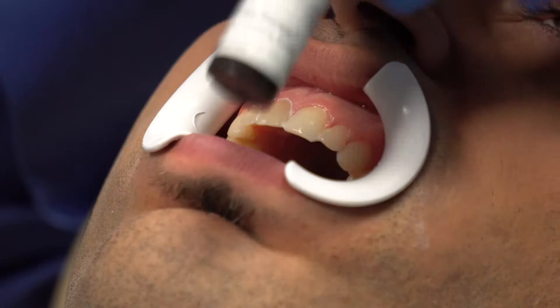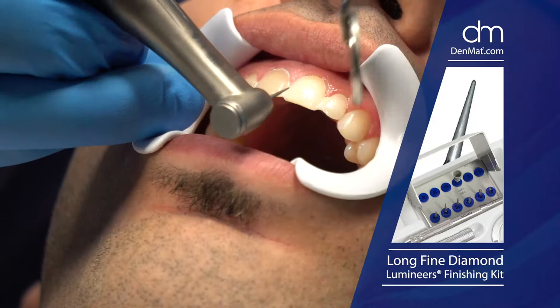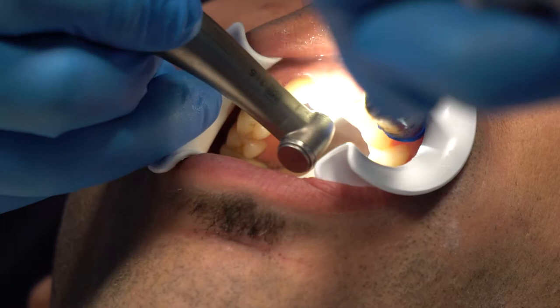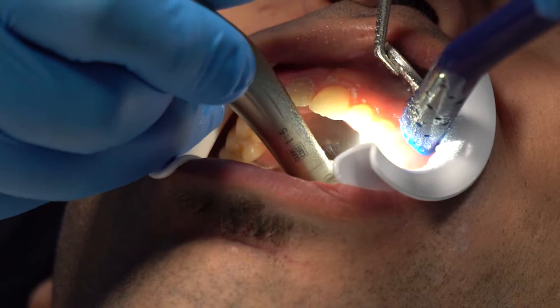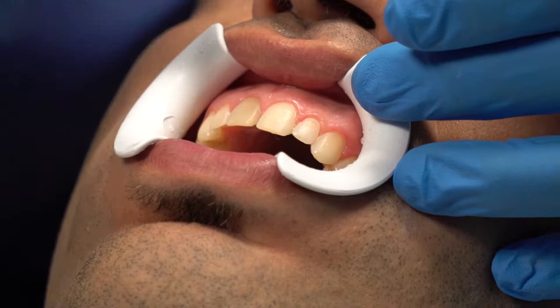He had a temporary on and before I get serious I want to take a fine diamond and run it over the surface — just to roughen up. He had a temporary on and we spot-bonded some teeth, so I want to make sure there's no resin in the middle of the tooth that might hold the veneer up slightly. Magnification is critical so you can see what you're doing. First go-to for no-prep that fits intimately: round the incisal edges ever so slightly — 99 times out of 10 that'll make it drop right down. Second go-to: the embrasures.